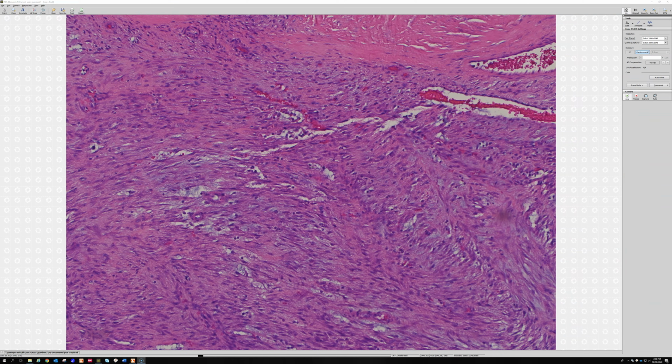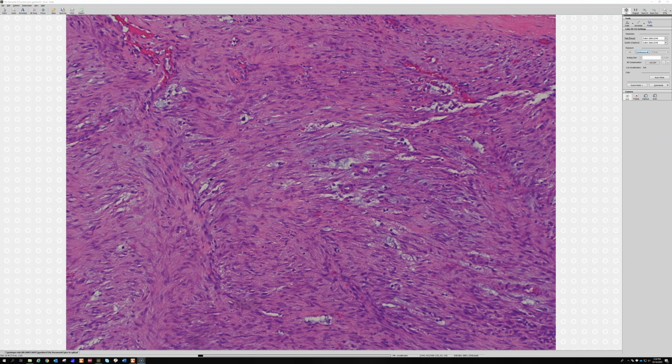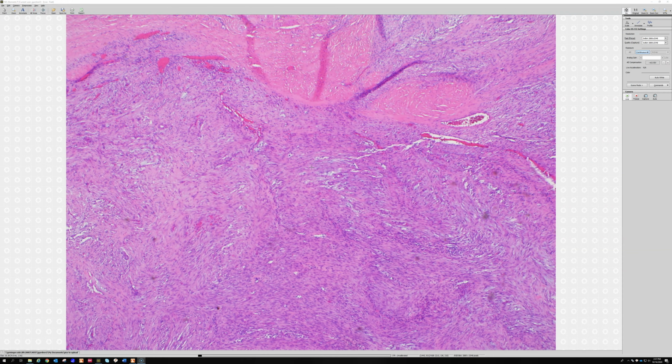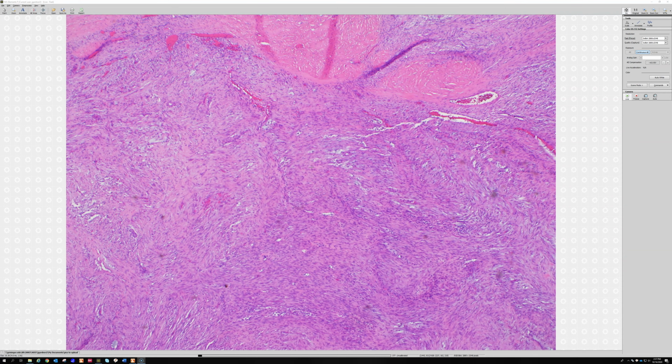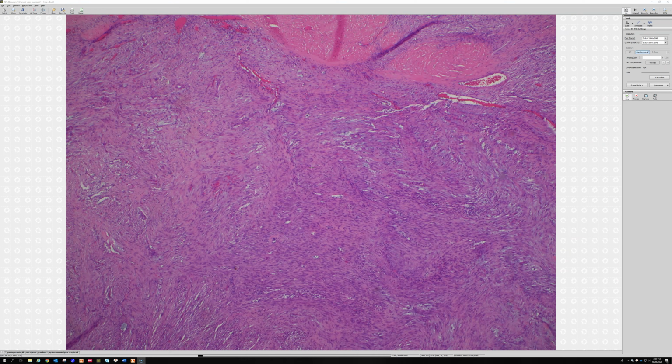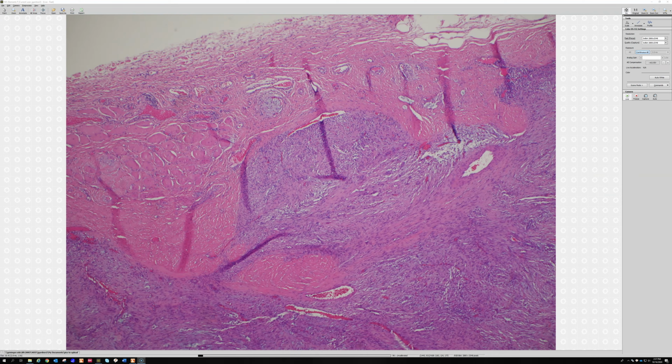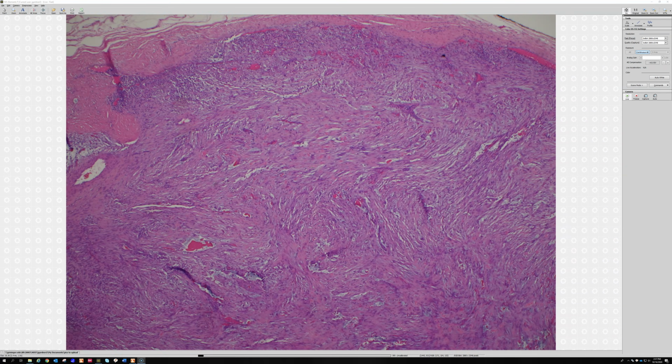Aneurysmal bone cysts have areas that look like fasciitis. Not all, but a majority of them, I think, have that same fusion, which is kind of interesting, especially because you can see this fasciitis-like appearance in that entity. So I really almost never need to test for that, although I've occasionally tested for it in cases where I was thinking about aneurysmal bone cyst versus other things. But for nodular fasciitis, I don't think I've ever actually sent it for molecular analysis.